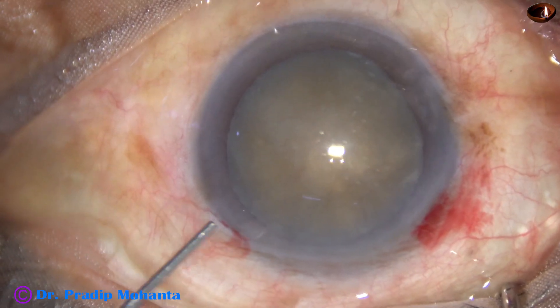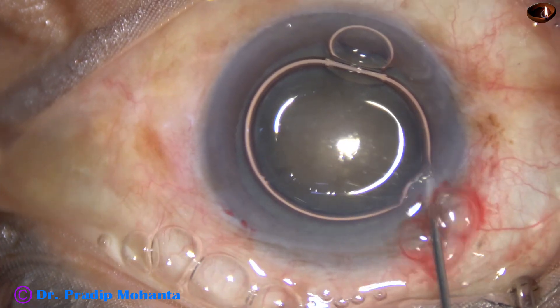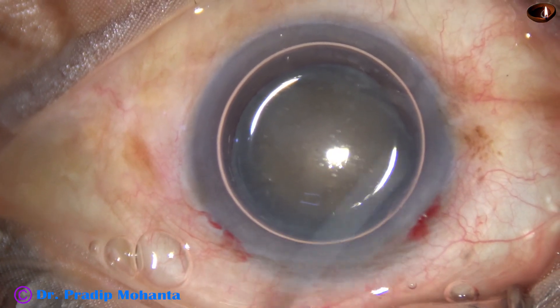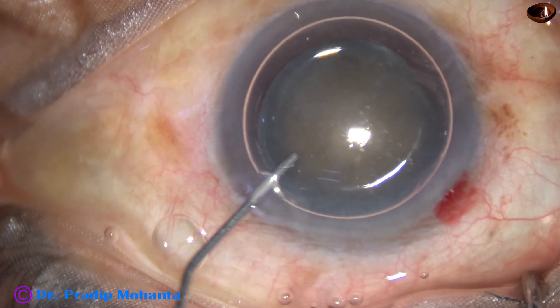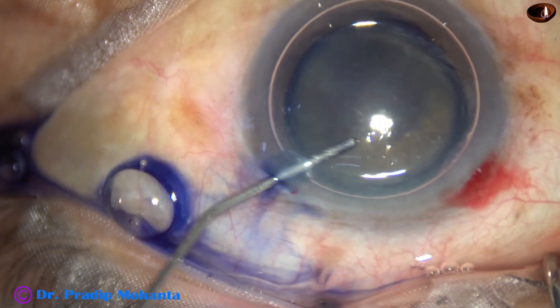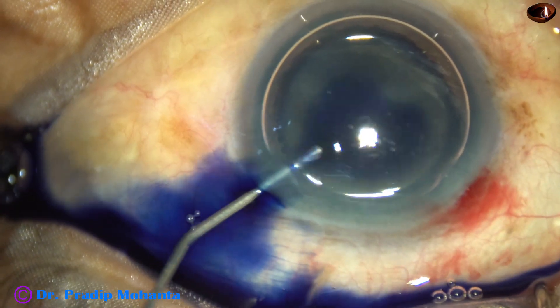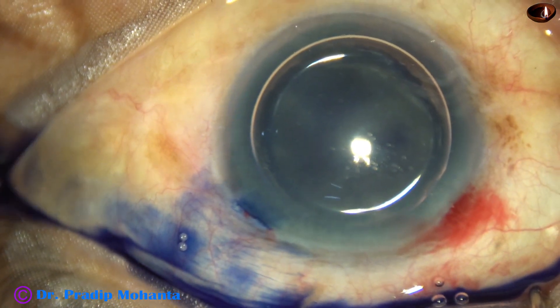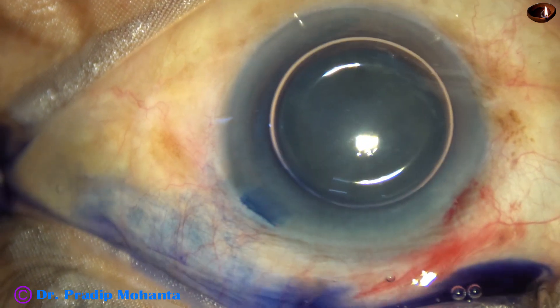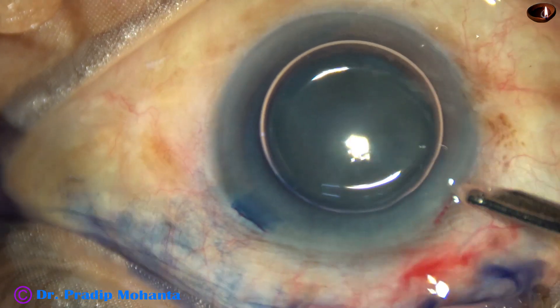An air bubble is injected to fill the anterior chamber. Beneath this air bubble, trypan blue dye is applied over the anterior capsule such that the dye touches all parts of the anterior capsule, ensuring uniform staining. This is a bit of adrenalin, and now the dye is washed out.